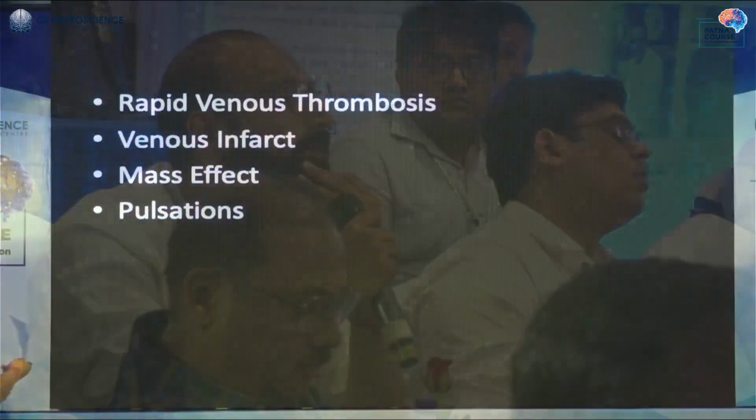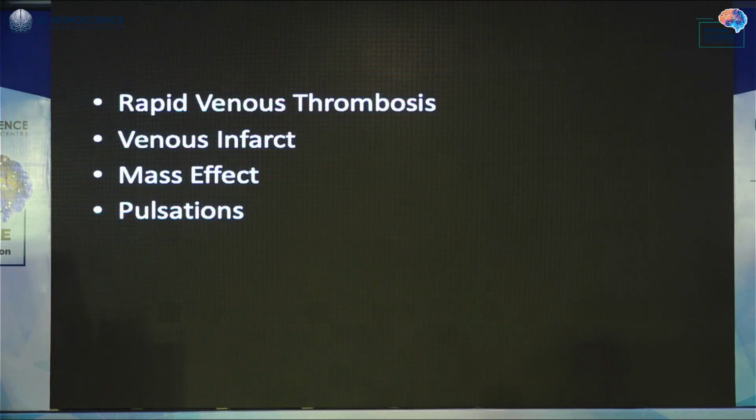Maybe. See, like what I'm showing here, this MR is probably, I think the pointer has given up. Anyway, that MR which I showed is just 24 hours post-procedure. So 24 hours post-procedure, all your dilated veins have disappeared. The venous engorgement takes 2 to 3 weeks to disappear.